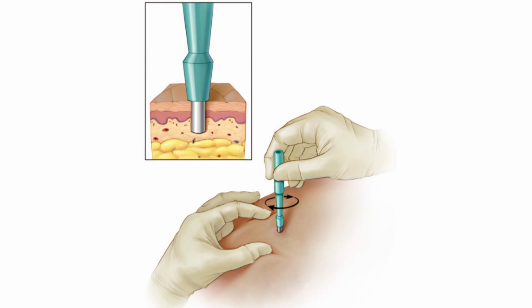When you rotate it gently, it goes deeper into the skin by cutting the skin layers, and you have to go to the whole depth of the blade, up to the handle. When you have completely gone to the depth of the blade, you just pull it out, and the sample comes along with it. Then we have to save the sample and send it for histopathology or genetic test as per your case. Now we practically see the steps of this procedure in the next part, where this procedure was performed on a patient. Thank you.